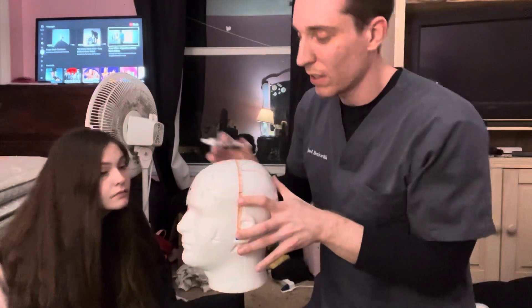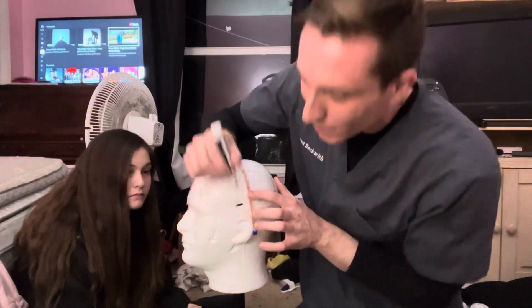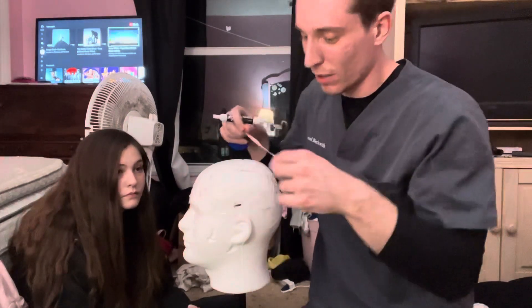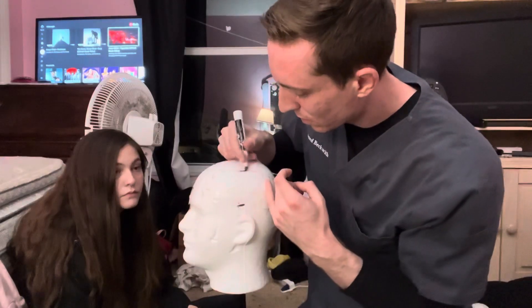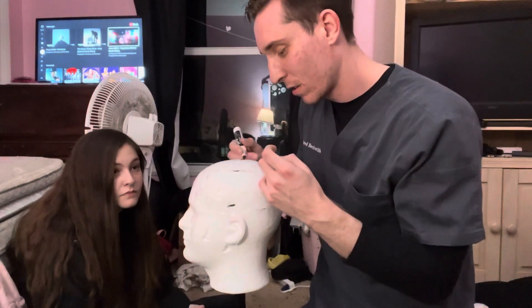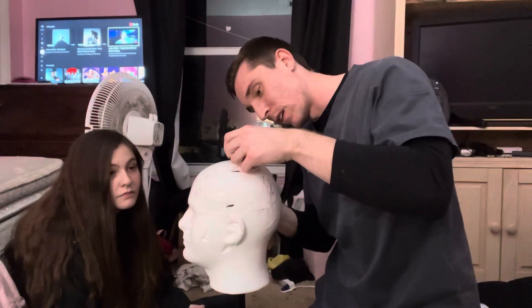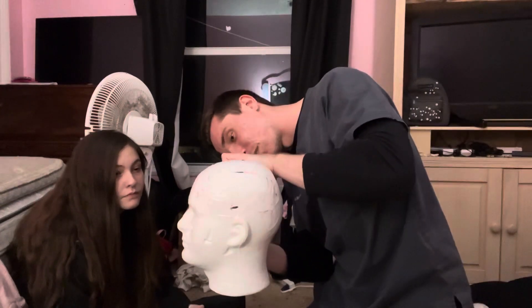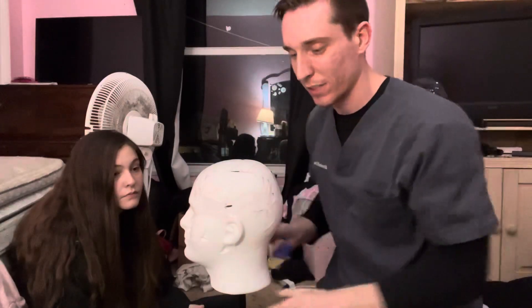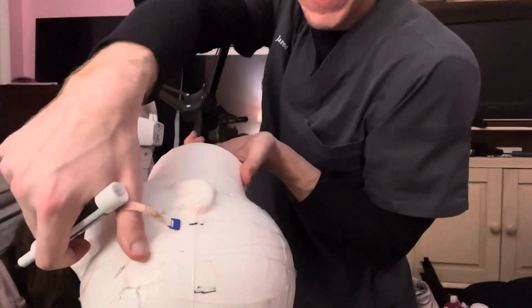Just like how we did front to back, it's the same thing from side to side. The first one is 10%, which is going to be 3.4 on the 34 centimeter measurement. And then we're going to do our 20%, which is you just double it — so 6.8. There's 6.8, and another 6.8 crossing our CZ mark, then another 6.8, and another 6.8. If you go down 3.4, then you'll get your other pre-auricular mark. So we have front to back and side to side marked.